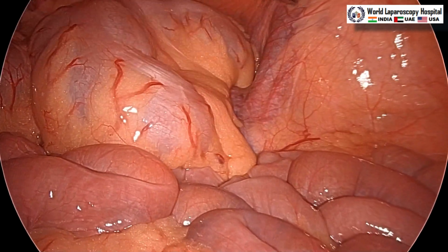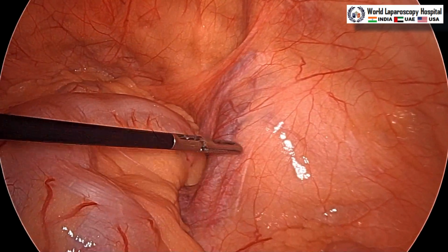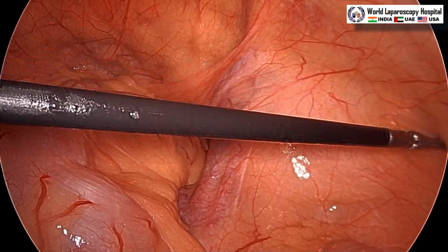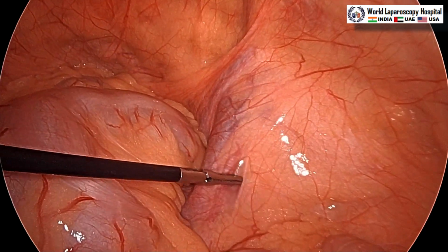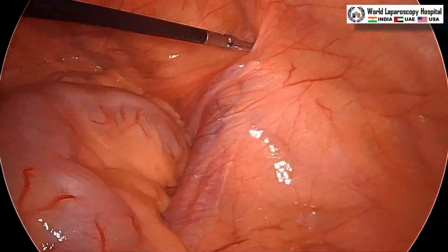vein. This area is the triangle of Doom, then here we can see the triangle of pain area, this is the deep ring, here is the inguinal ligament area, and these are the nerves, LFCN and GFN.